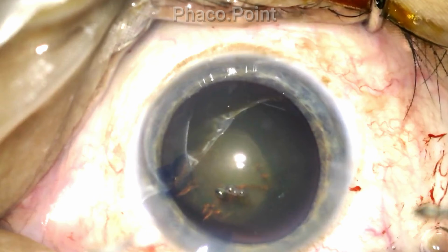Now, this undersized and eccentric rhexis is going to make phacoemulsification fairly challenging, with a difficulty in negotiating the fragments in and out of the bag and a high potential of damaging the rhexis edge inferiorly. Therefore, it is imperative that we enlarge the rhexis, and here's how it's done.